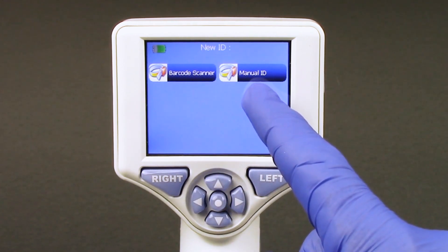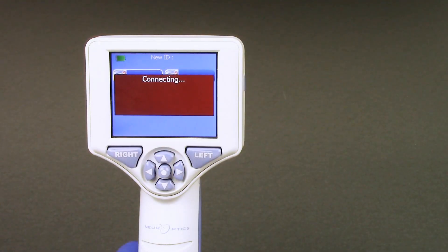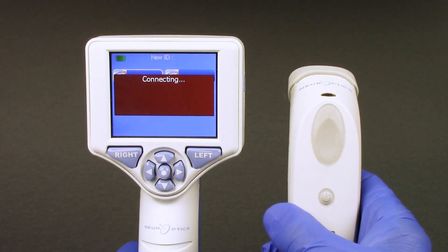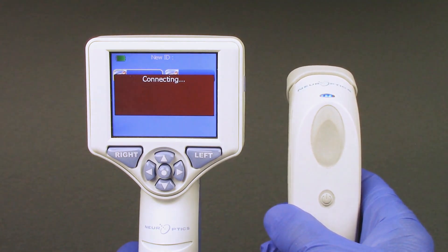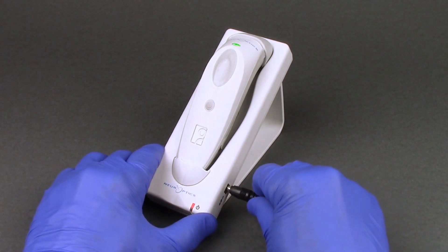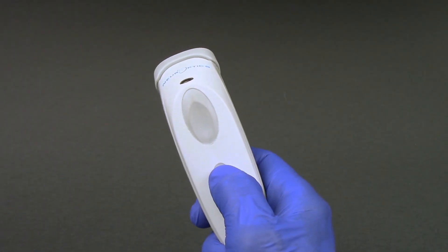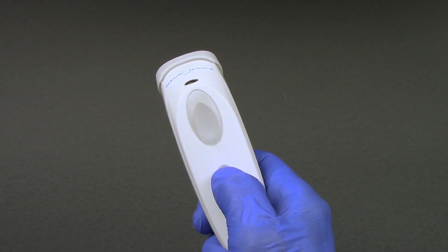The patient ID is only required to be entered into the smart guard on the initial setup only. When using the barcode scanner to enter the patient ID, the NPI 200 pupilometer must first be paired to the Neuroptics barcode scanner. Connect the barcode scanner seated in its charging cradle to the power supply and plug into a power outlet. Turn on the barcode scanner by pressing and holding the button until an audible beep is heard and a blue light on the device flashes.